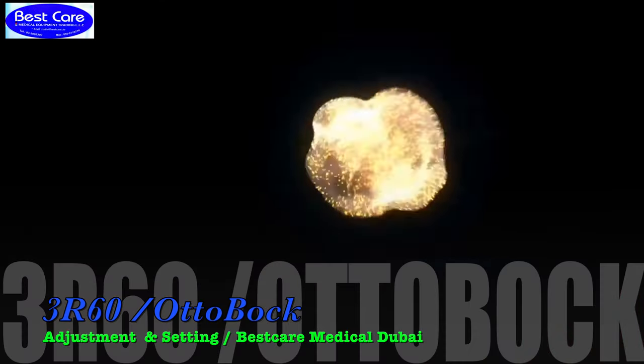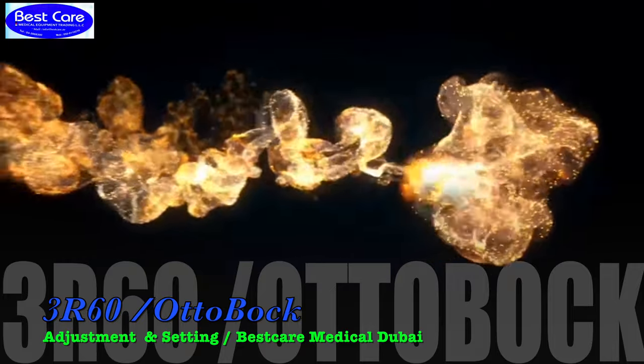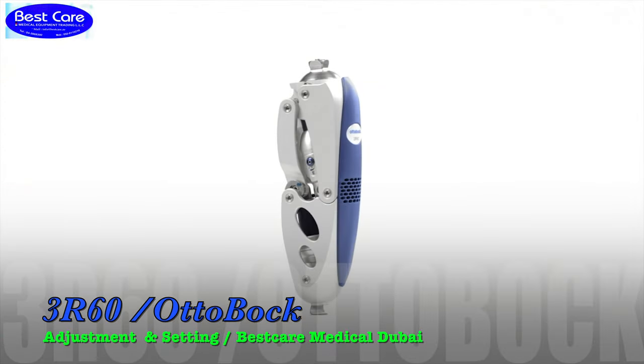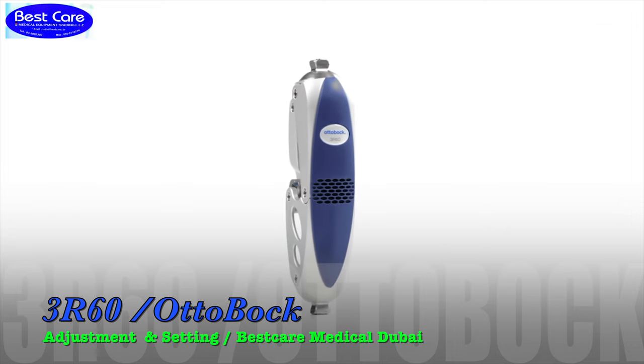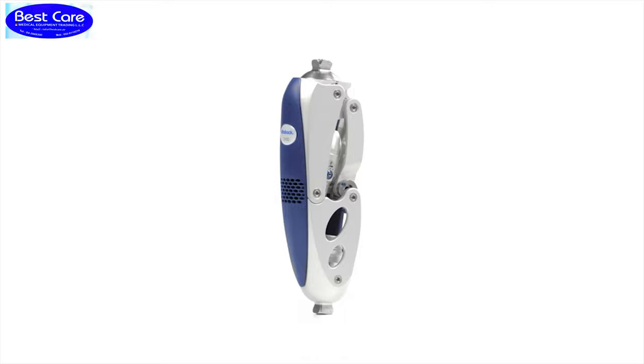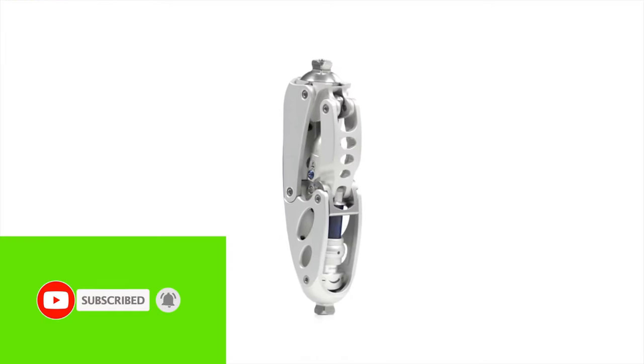Welcome back to BestCare Forum. The polycentric knee joint 3R60 with hydraulic swing phase control is recommended mainly for MOBIS III lower limb amputees with a body weight up to 125 kilograms.